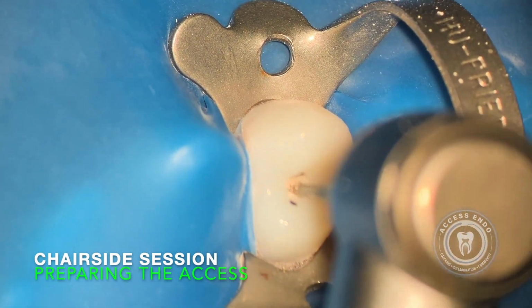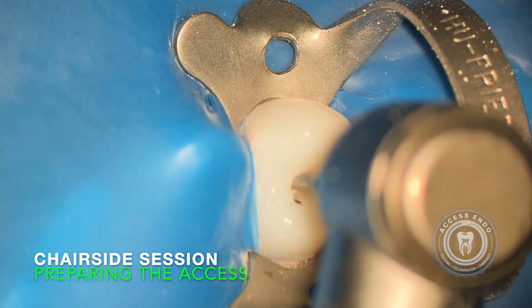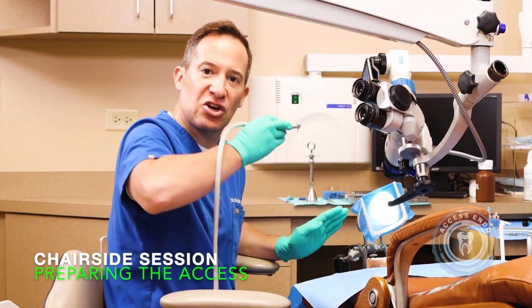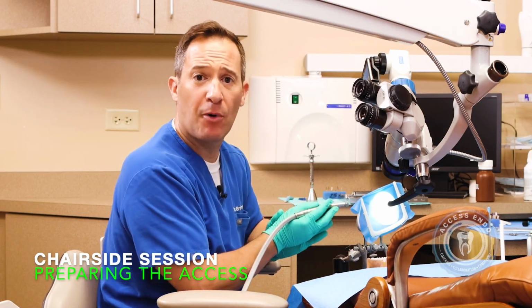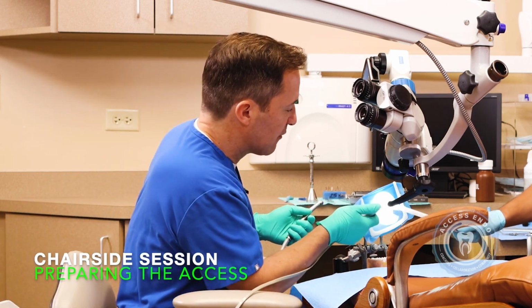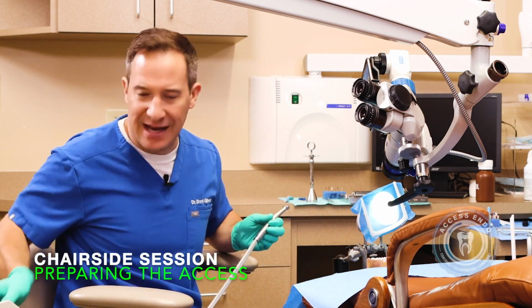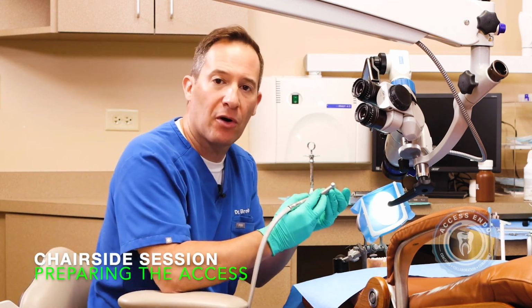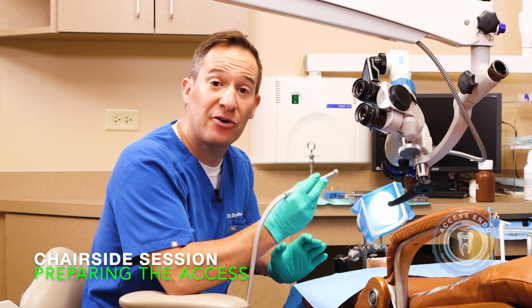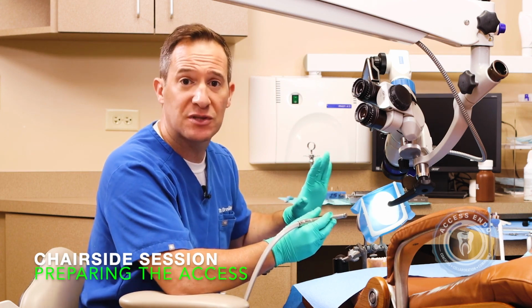Again, I'm just going to make a little more penetration. You'll see I'll do this stroke where I just touch it and withdraw, maybe come up the buccal or palatal wall, but I'm not just going for it. I'm not going to take that burr straight down into the pulp chamber because that's risky, and I don't want to take any chances of perforating. So I'll do a little cleanup here. With this round burr, or any burr you use, you're going to have a real tactile change once you get to the pulp chamber. So I know I'm getting close here.